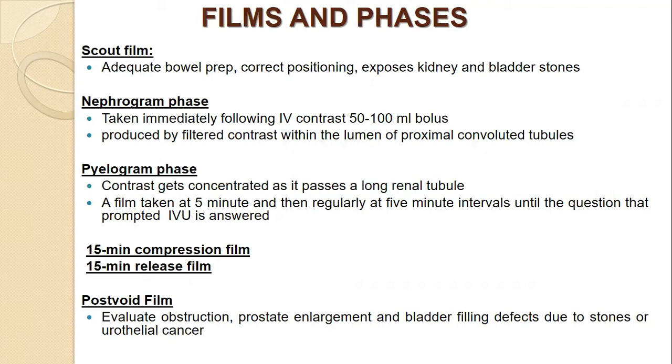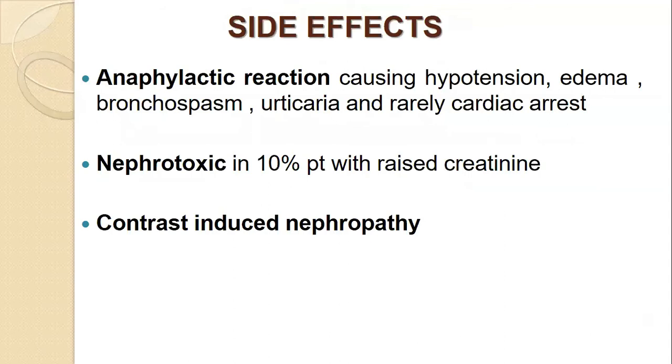And the next film is the pyelogram phase. The contrast gets concentrated in the tubules, and a film is taken at 5 minutes and then regularly at 5-minute intervals until the question that prompted the IVU is answered. The next films are the 15-minute compression film, the 15-minute release film, and the post-void film. The post-void film shows prostate enlargement and bladder filling defects due to stones or urothelial cancers. The side effects of IVU, most commonly, are anaphylactic reactions, nephrotoxicity, and contrast-induced nephropathy.